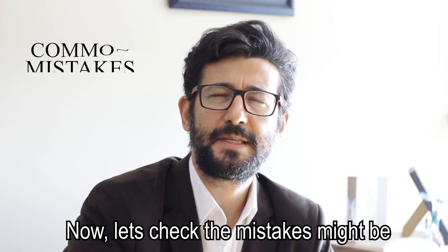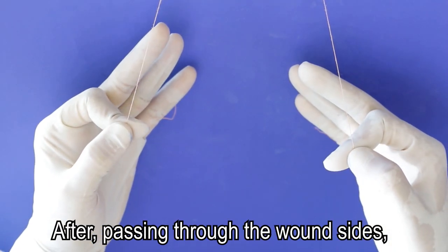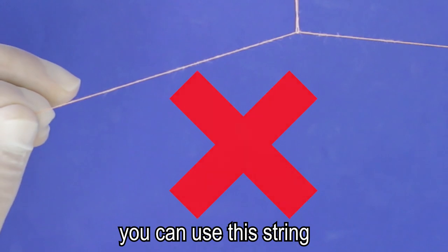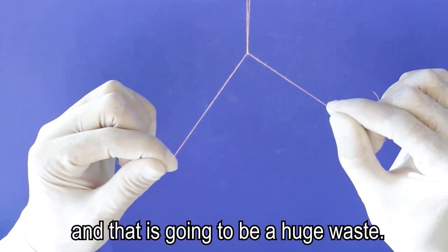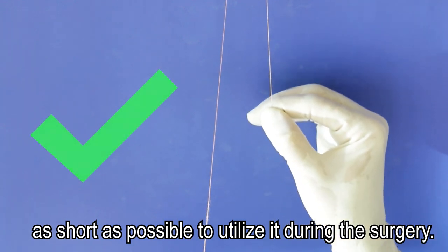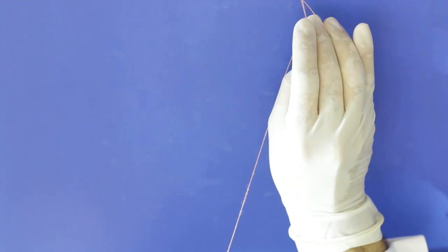Now let's check the mistakes that might be made during suturing. After passing through the wound sides, if you leave equal length for both sides, you can use this string just for one knot. And that's going to be a huge waste. So keep one side of the string as short as possible to utilize it during the surgery.